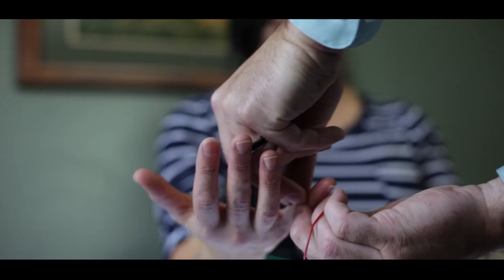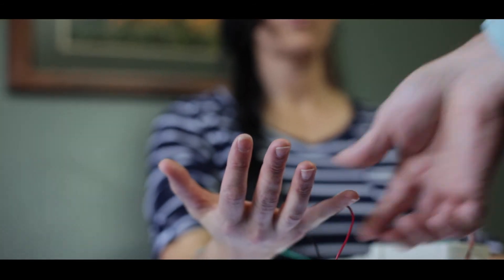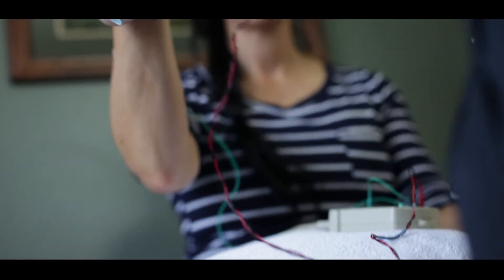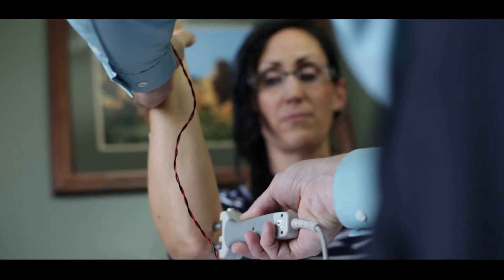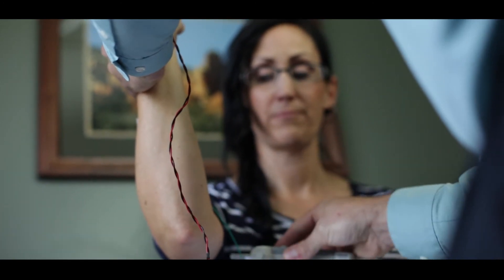Nerve conduction involves stimulating through a handheld device, putting a low level of electricity into the nerve to activate it, and then we have electrodes placed on the skin that measure the response. From nerve conduction testing, we can see how healthy a nerve is, how fast it conducts, and what the size of the response is, which gives us an idea of how many healthy nerve fibers are present.